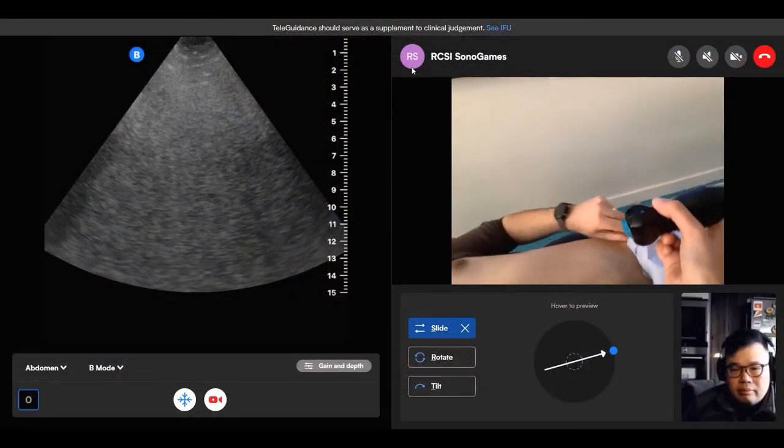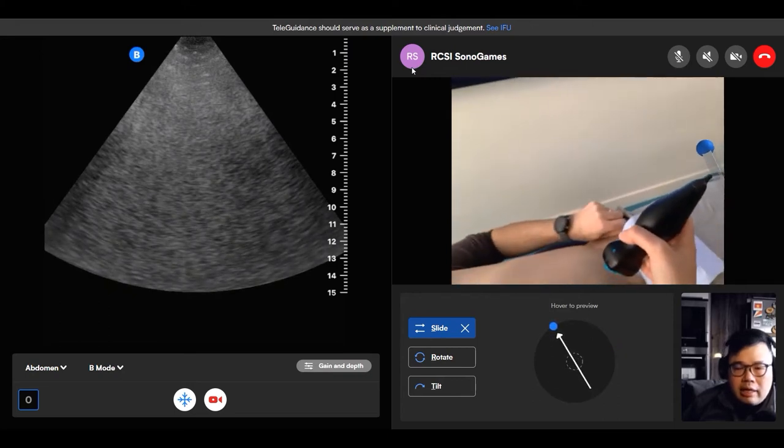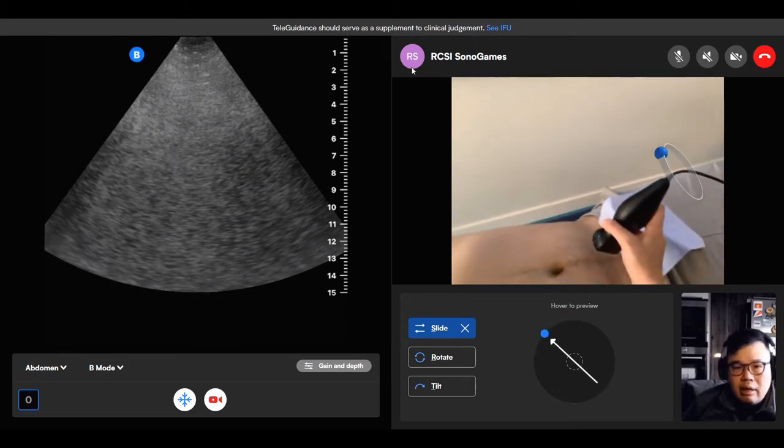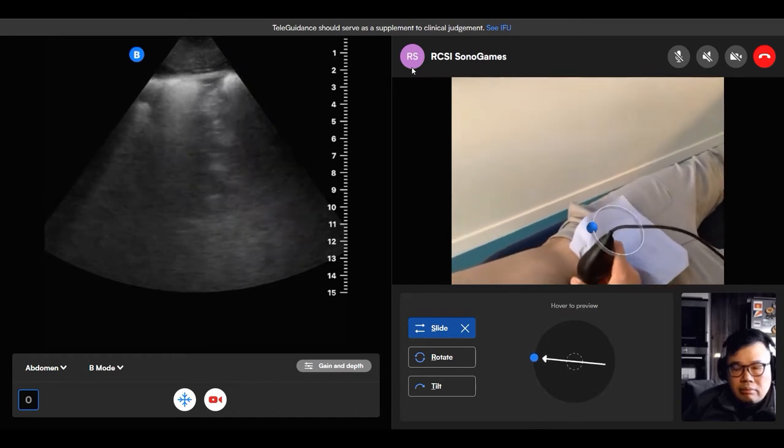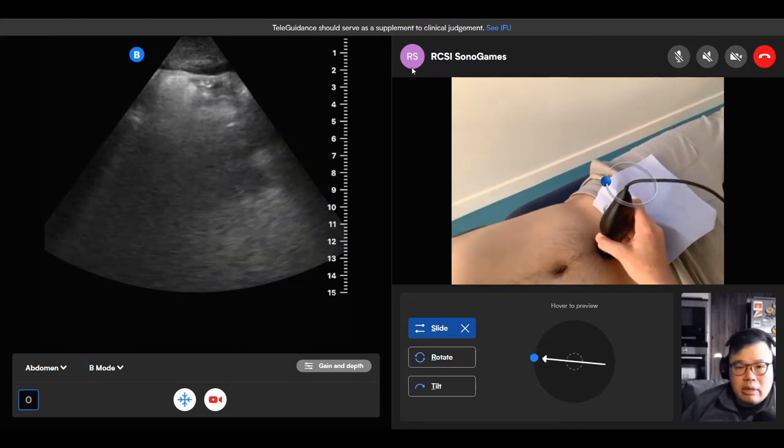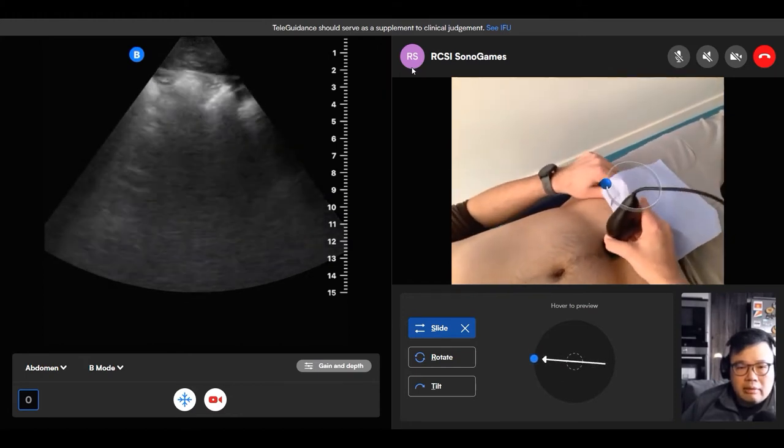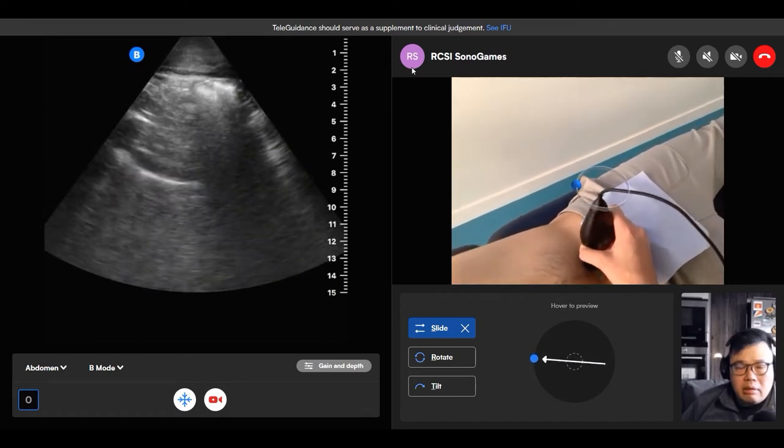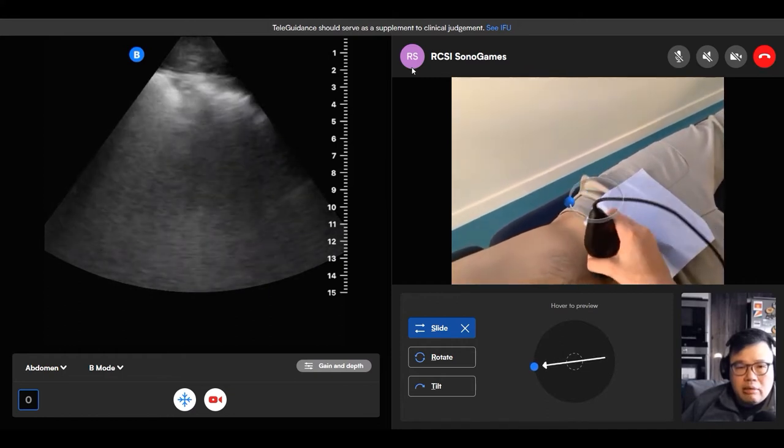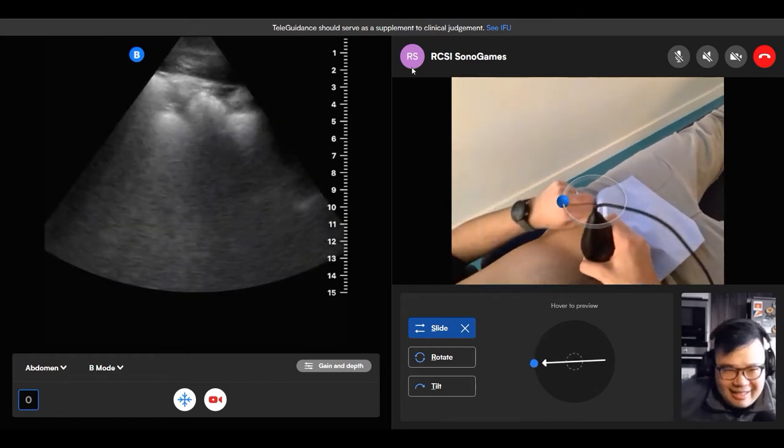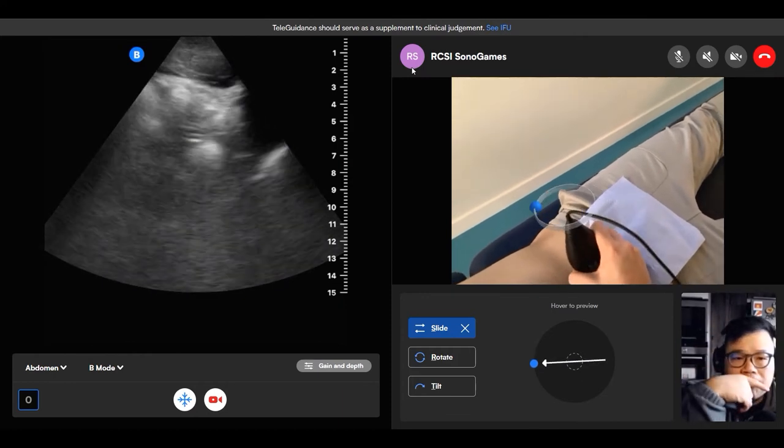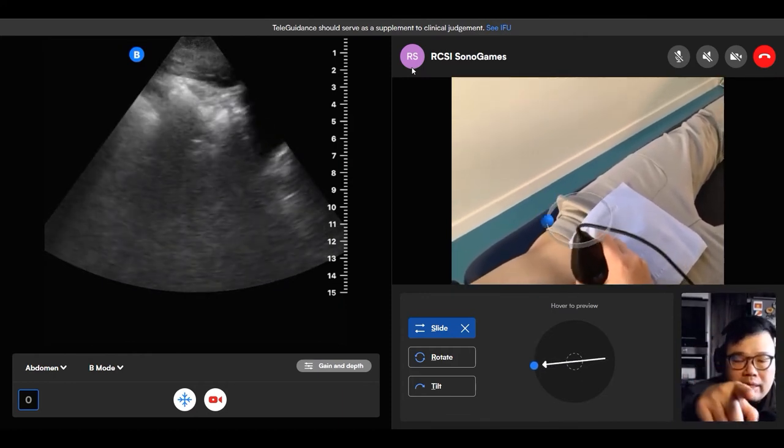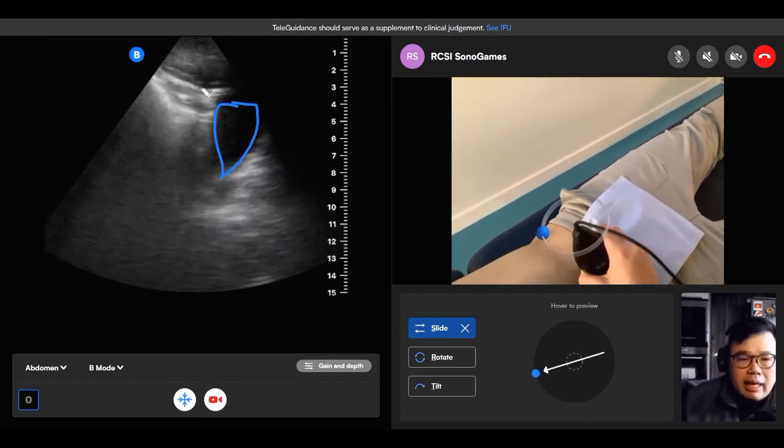For the pelvic view, is the probe positioned towards the head first? Yeah, you can do it towards the head first and then after that you can do it as a transverse view. So you need to actually go a little bit lower, I would suspect. Probably need to go just that little bit lower. Unfortunately, it has to be uncomfortable for you and the model. Because what you're seeing here is actually just bowel. There you go. So that's the... I'm seeing bladder over there. Yeah, you're seeing bladder in the kind of the right side of the screen over here.